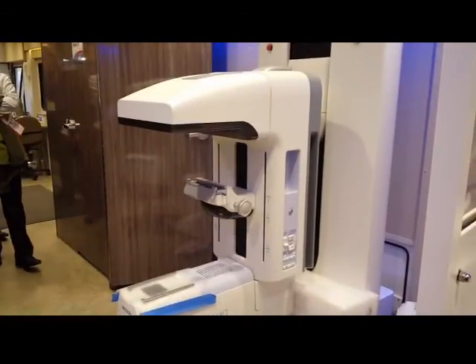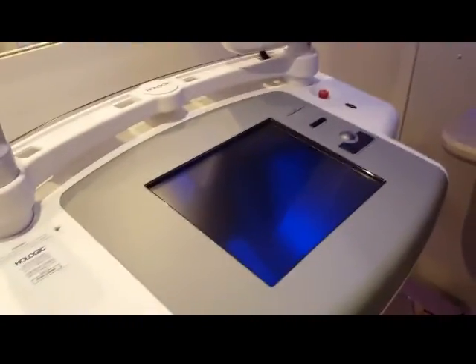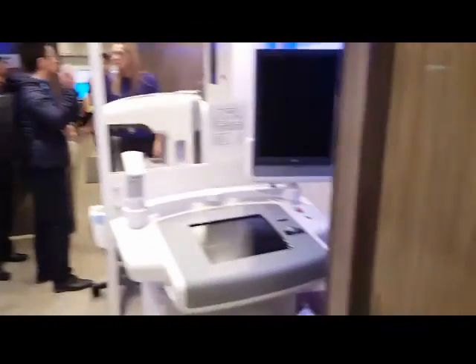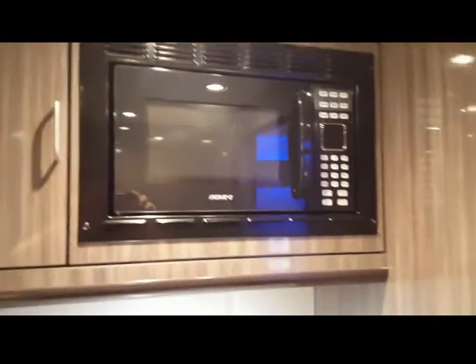It looks like they've got this thing turned upside down — maybe I should tell them that. So here's the tech workstation. And then over here, I guess, is where you do your paperwork, maybe. Here's the break room. There's the microwave. These are locked. Not much to it.